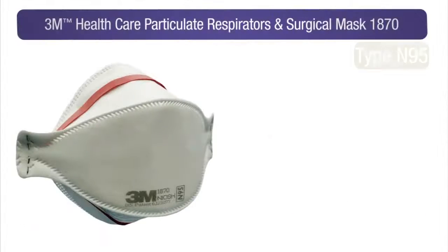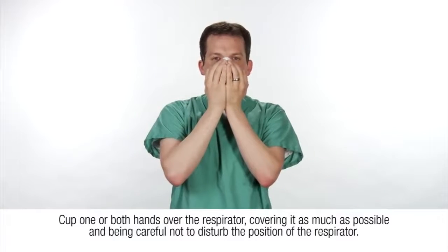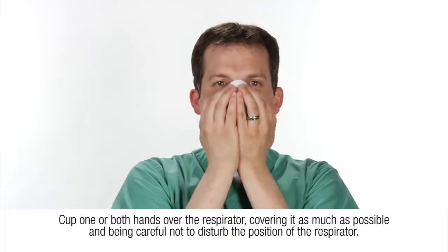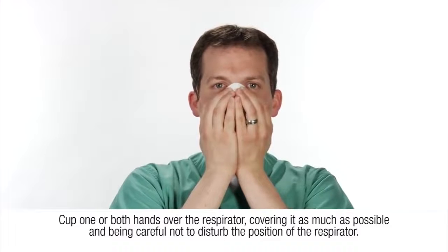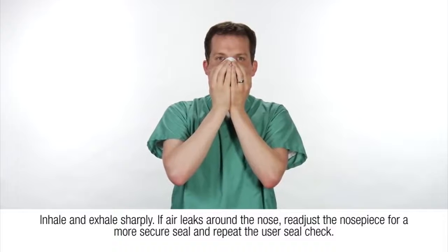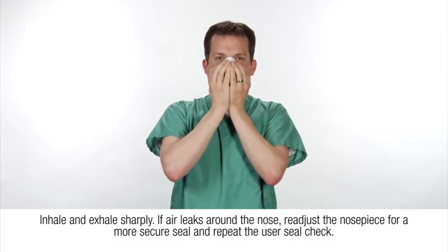Perform the user seal check each time you don a respirator. To conduct a user seal check, place one or both hands completely over the middle panel, cupping hands over the respirator and covering it as much as possible. Pay careful attention not to disturb the position of the respirator. Inhale and exhale sharply. It is important to have a good face to respirator seal.